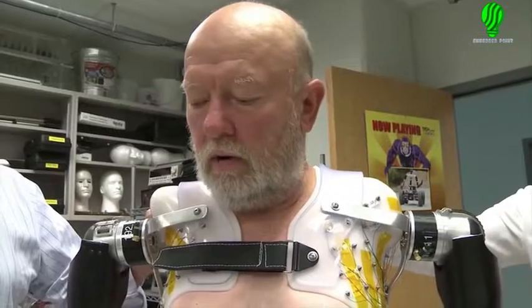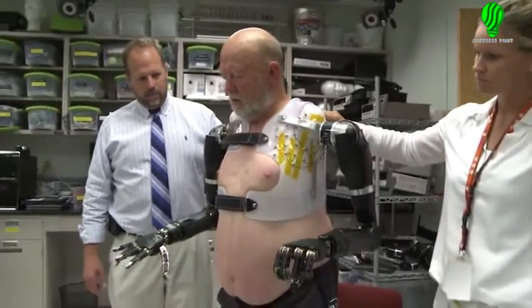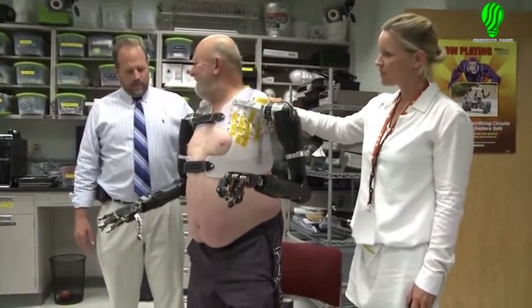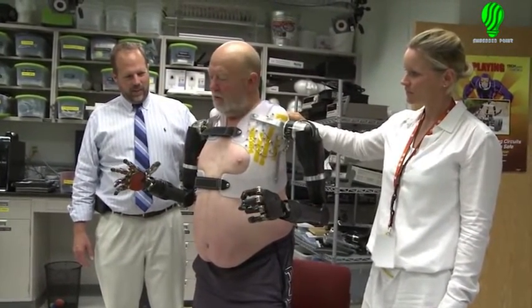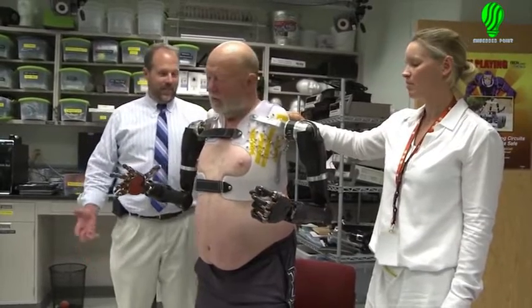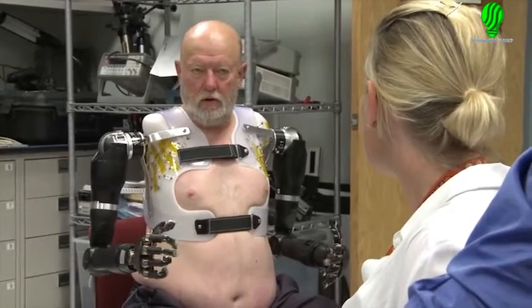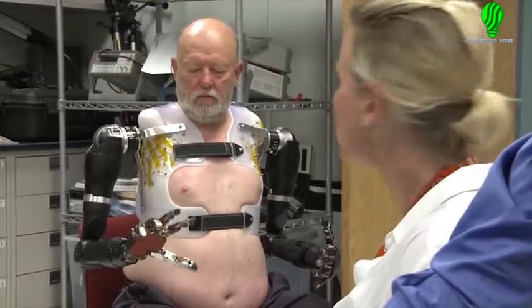The next five, ten years are going to bring some really phenomenal advancements. Other milestones reached by the team were that this was the first time the MPLs were operated by a shoulder-level amputee at the full three degrees of freedom and with over 30 total degrees of motion on both sides with complete intuitive thought-based control. He has access to all of the different degrees of motion — shoulder, elbow, wrist, hand — but he still needs to select which one he wants to use, positioning each separately and resting in between.